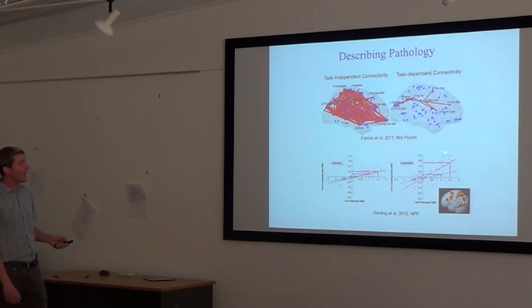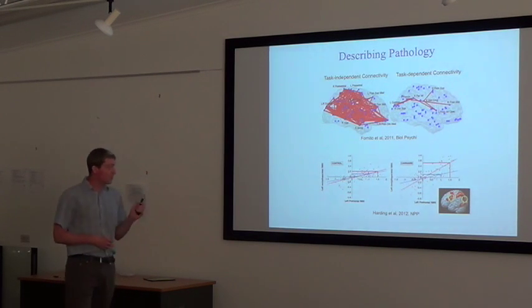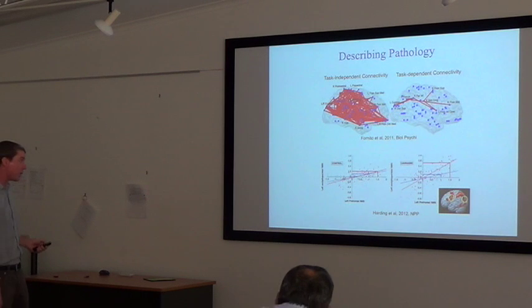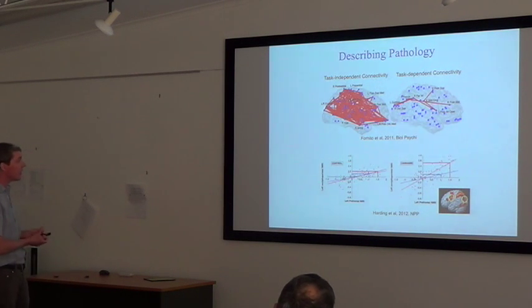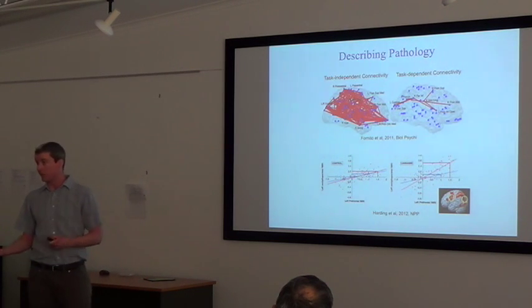And this is that task-related connectivity going from the lateral prefrontal cortex to the occipital-parietal cortex that I had shown a couple of slides previous. This was actually a study that we did in cannabis users. We found that this connection, which is thought to drive attentional processing, was modulated significantly in cannabis users during an executive task, but not in controls, indicating a task-specific hyperconnectivity of this connection.